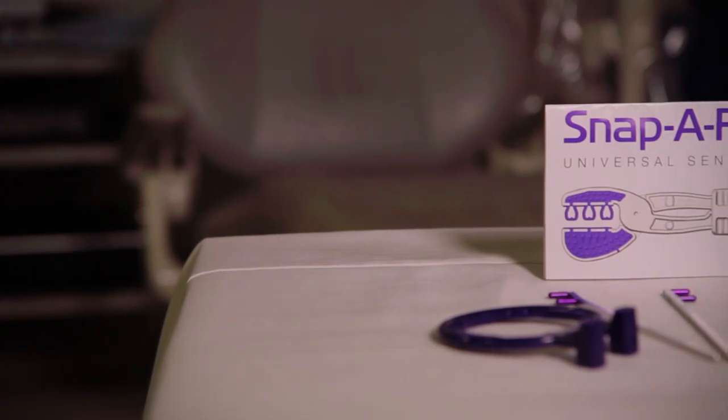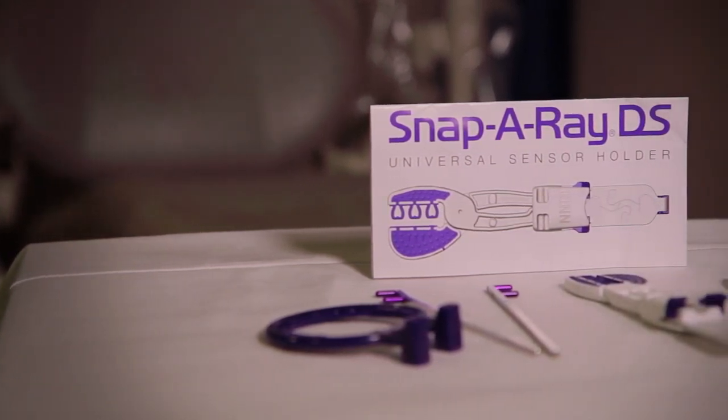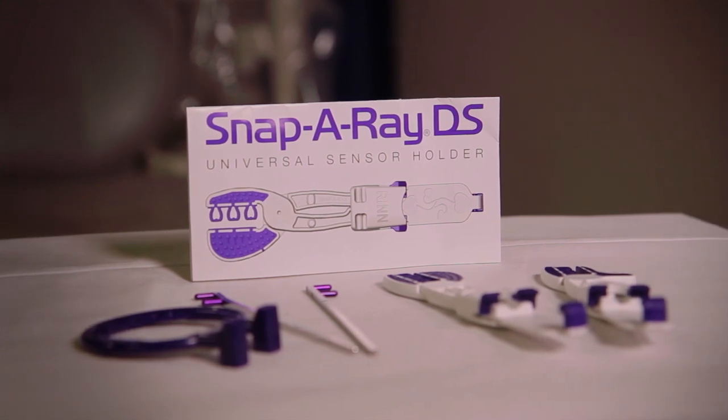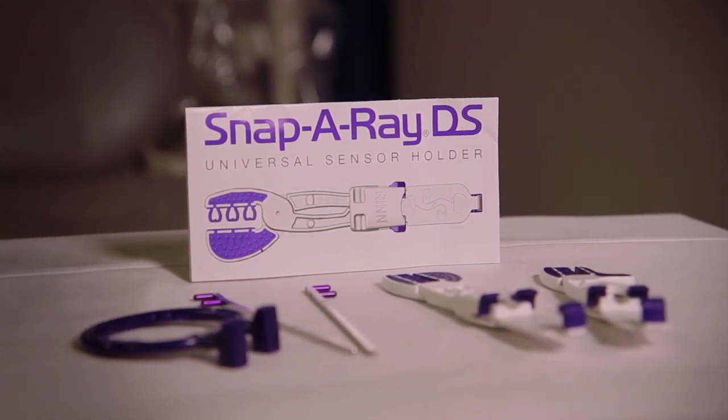Some of the most challenging x-rays are taken during an endo treatment. The working images needed need to be placed behind the rubber dam, which can be very challenging. What I'd like to show you today is how to assemble the Snap-A-Ray DS and show how it can be placed behind a rubber dam and also include the apex of the tooth.